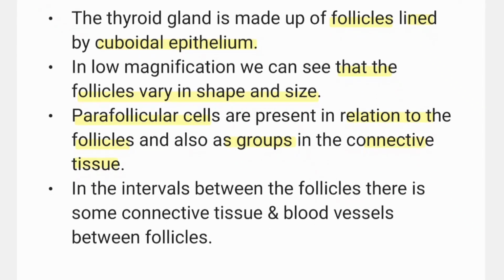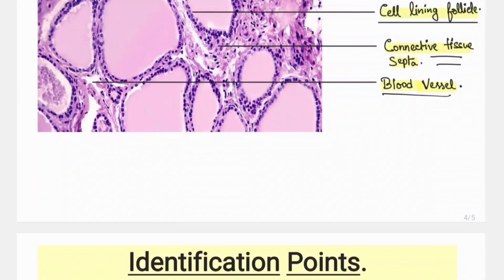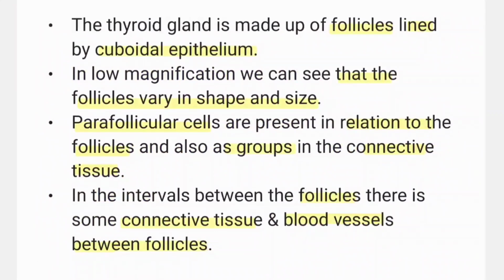In the intervals between the follicles, there is some connective tissue and blood vessels, as we have seen in the previous diagram.